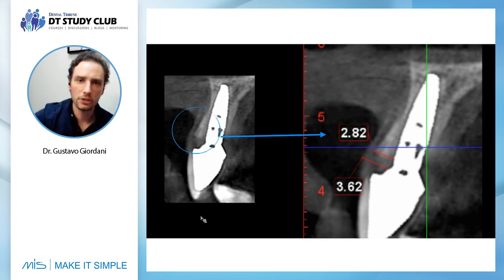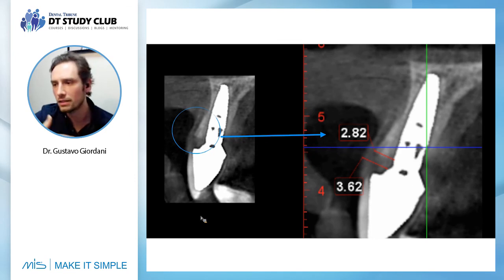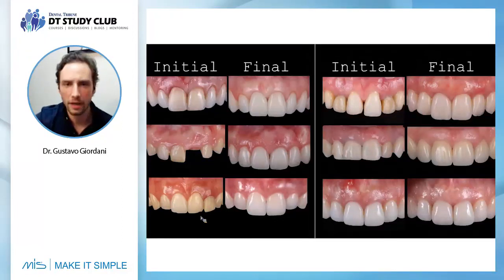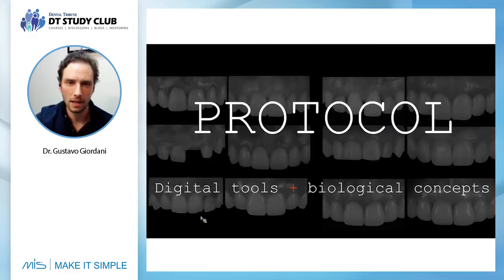With this, the literature and also our clinical experience show that this is very stable. So we are using this as a protocol in all of our cases. I can stay here showing initial cases and final cases, but the protocol is the same. We are doing exactly the same in our cases because by just respecting these steps, we can create very easy and predictable restoration. Combining the digital tools, using a very good implant like V3 and a guided surgery, and of course, respecting the biological concepts for our restoration.